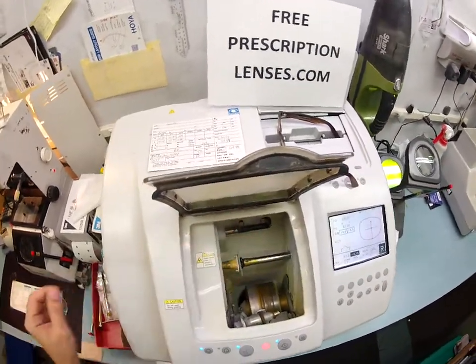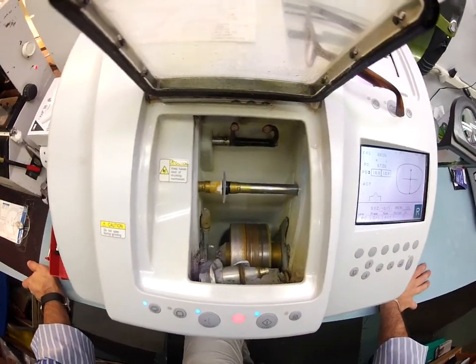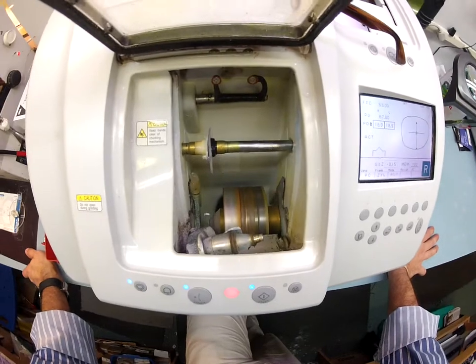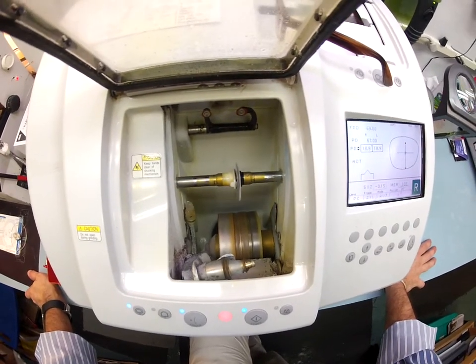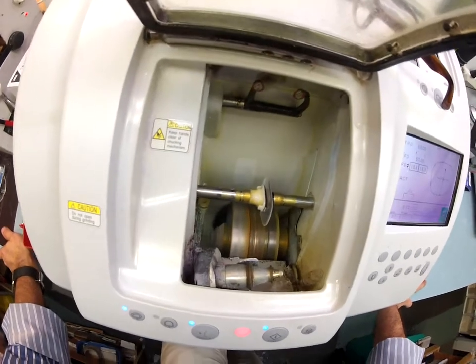I always start off a little bit large with the first lens. Once I get the size just right, I'll flip it over and cut the left. Now, the golden rule: you can always cut more off of a lens, you can never add back onto it. So I start a little bit large and work my way down.